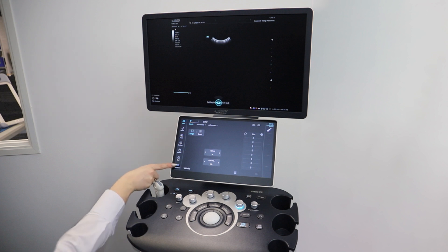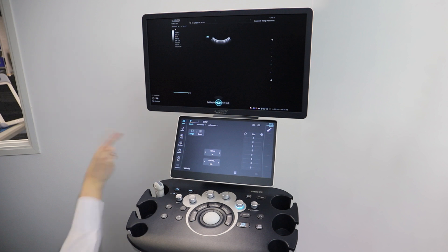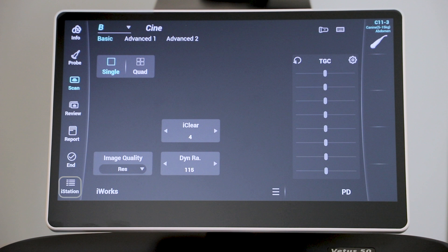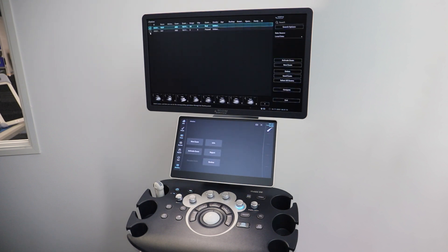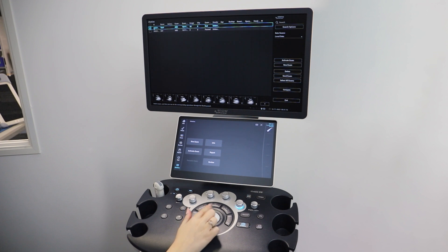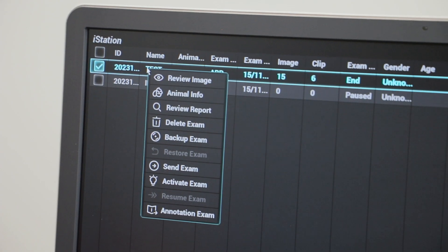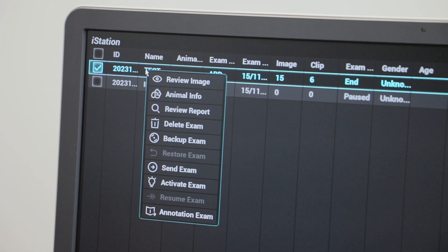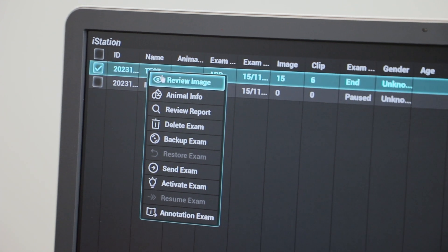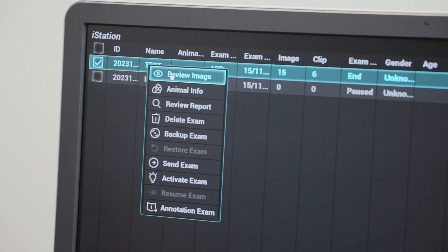If you wish to review images or videos from any patient file, click on iStation which is located on your menu table. From here you can click into any previous patient file. It is possible to add comments and measurements to existing patient files. Just remember to save any updates you make by pressing the save button.